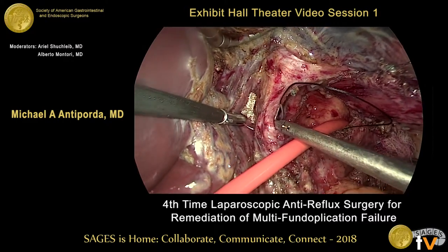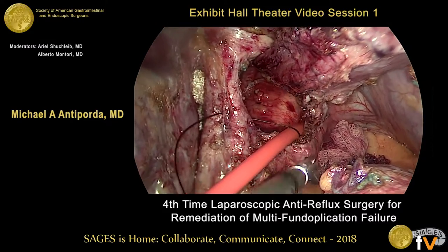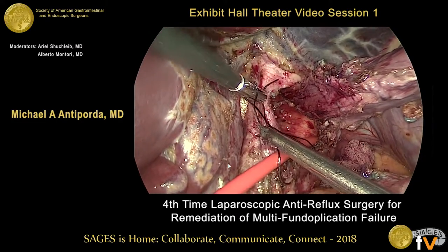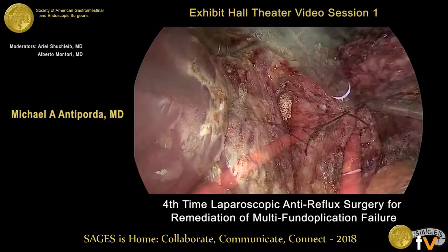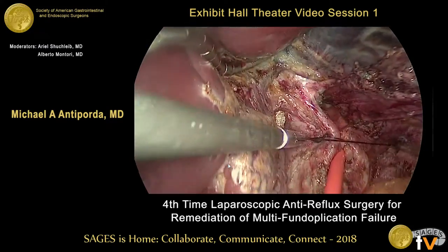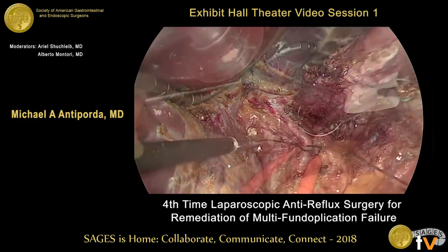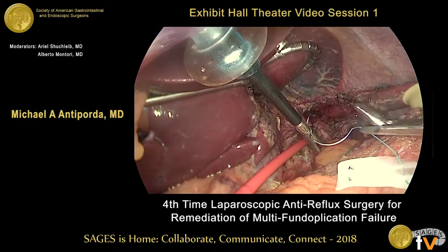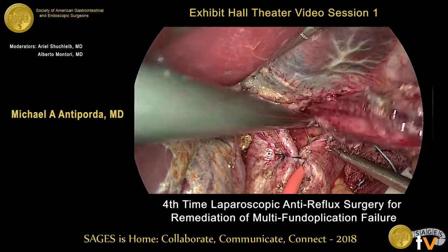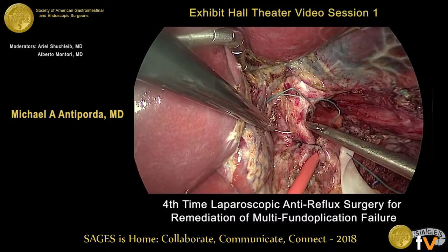We begin approximating the crura. This is first accomplished with a zero silk in interrupted fashion, and all knots are tied intracorporeally. Next, a horizontal mattress stitch of zero Ethibond is placed, incorporating a strip of biosynthetic mesh. With this closure, we are able to approximate the empty esophagus without constricting it.